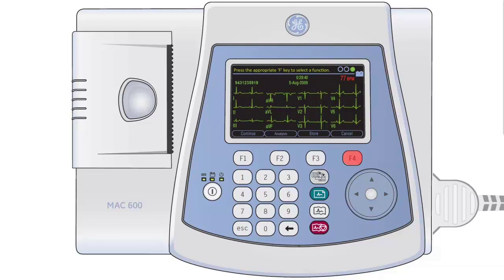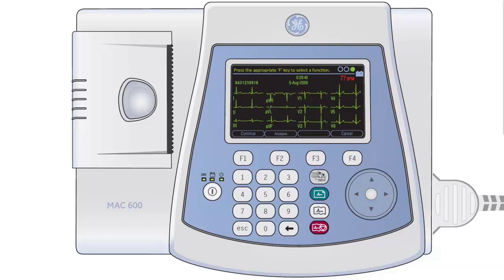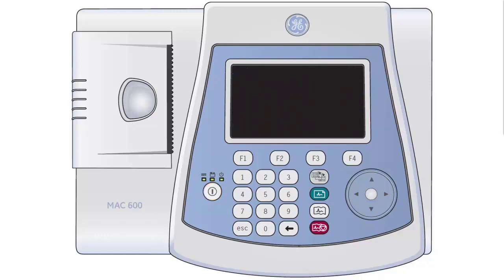If you are happy with the ECG you have captured, press the F3 button to store the ECG. The stored ECG can be printed if required by pressing the F1 button. The patient can be disconnected now from the machine. Switch off the ECG machine by pressing and holding down the power button for 5 seconds until the display goes blank.